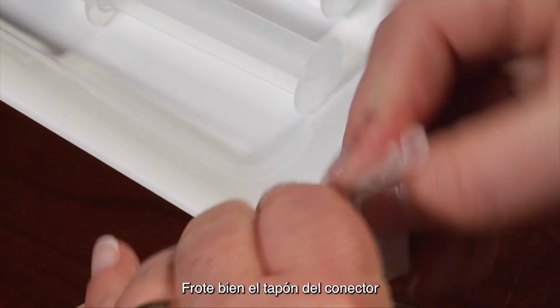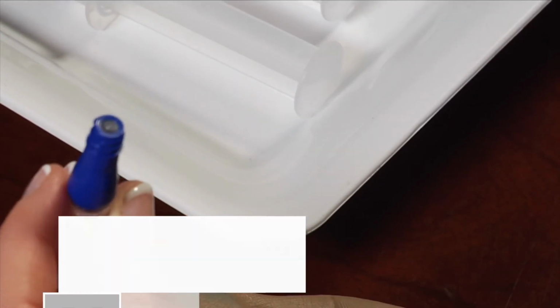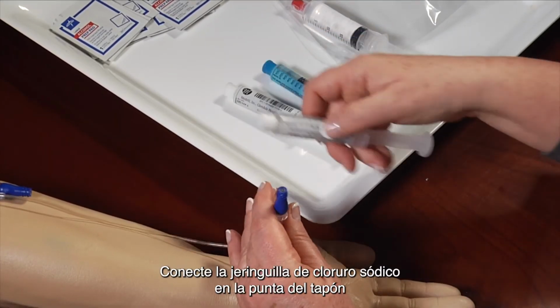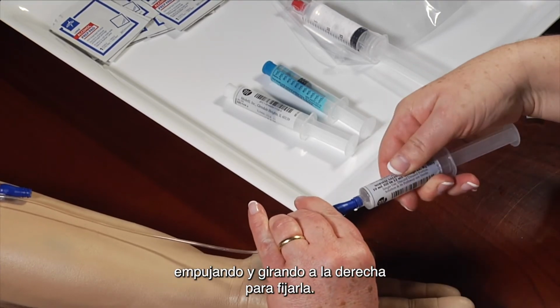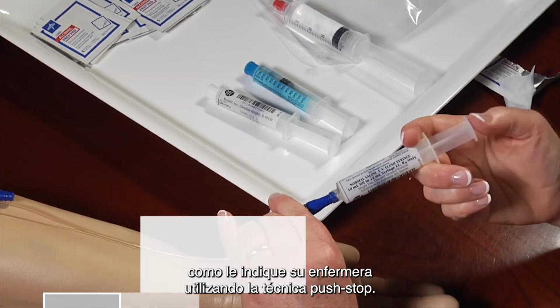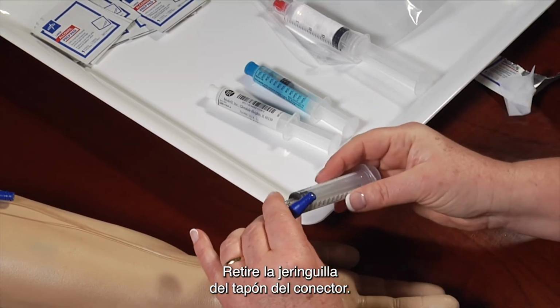Scrub the hub of your injection cap vigorously for 30 seconds with an antiseptic wipe. Allow to dry for 60 seconds. Attach the pre-filled syringe of sodium chloride to the end of your injection cap by pushing and turning clockwise to secure the syringe in place. Flush the catheter with the contents of the pre-filled sodium chloride syringe as directed by your nurse, using a push-pause method. Note any sluggishness or resistance of flow. Disconnect the syringe from your injection cap.